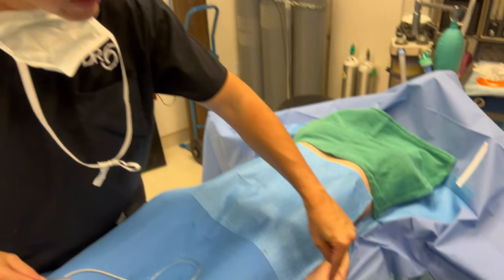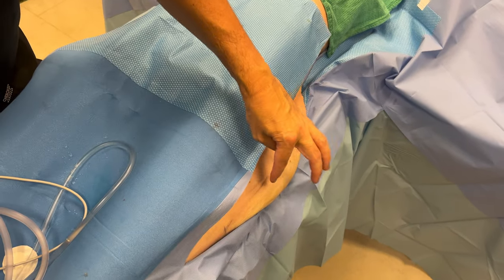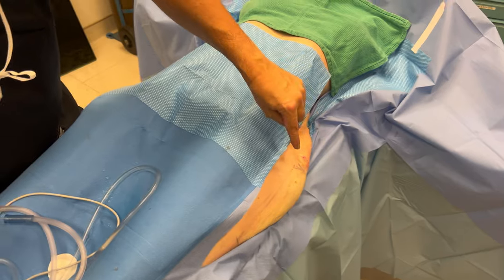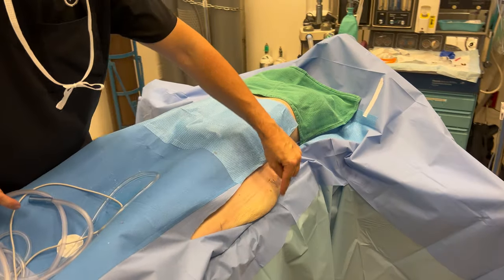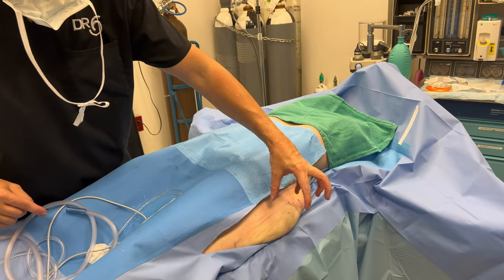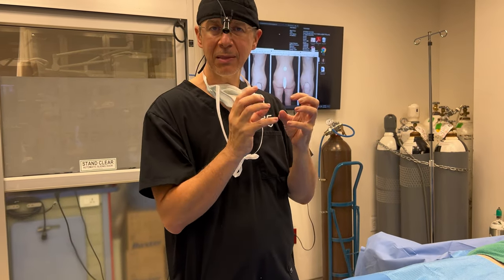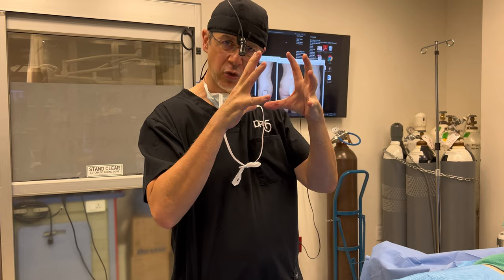So we're done. We took about 100 cc's of fat from here — it's not a lot. There's still a saddlebag, but we took just enough to correct what was bulging out. And then we used the Renuvion J-plasma tool to try to tighten the skin. Now we've had a thermal injury; over the next couple of weeks it'll tighten up. It takes about three months to see the final result as the tissue stiffens and contracts.